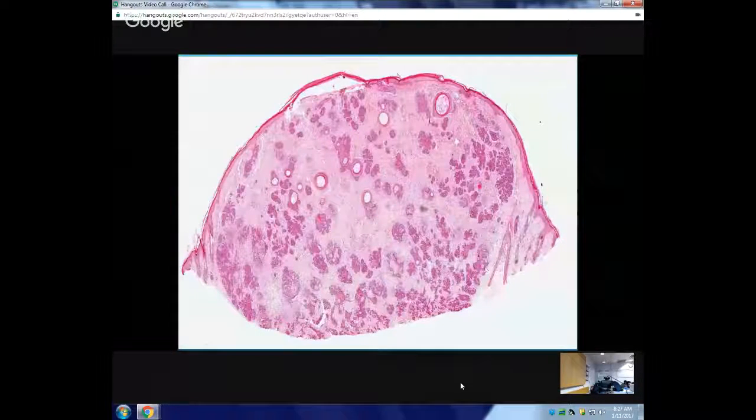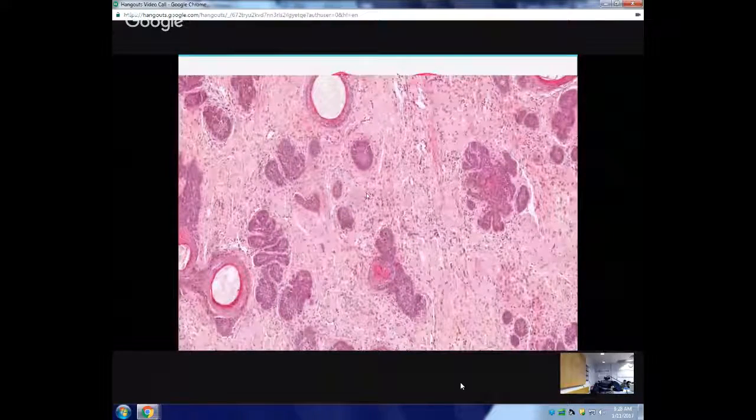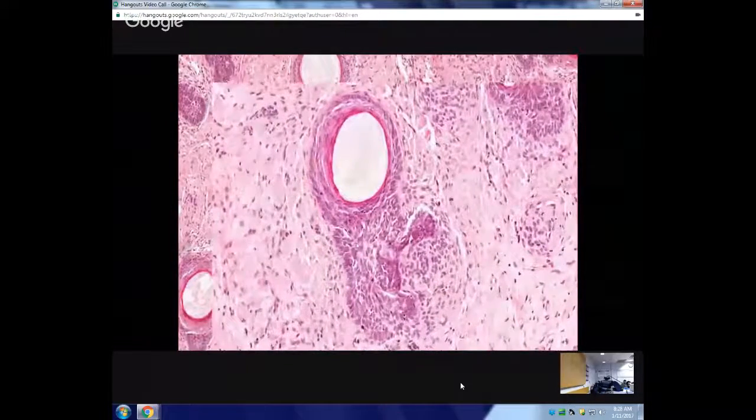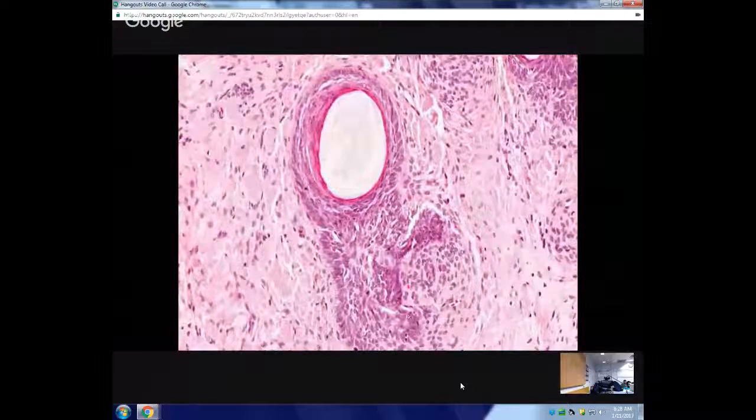So this is a classic. What is this one? Again, what is the neoplasm? It is a basaloid neoplasm. Okay, hair follicle. So again, you go through the same features, but what is the very classic thing that you're seeing here? Keratocyst. So now you know you're most likely dealing with a trichoepithelioma: no mitosis, no apoptosis, keratocyst, and you can see the papillary mesenchymal body.